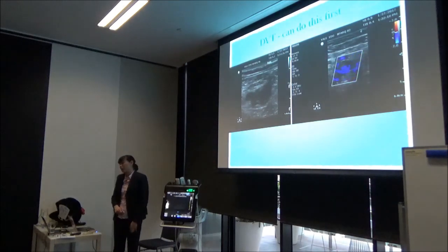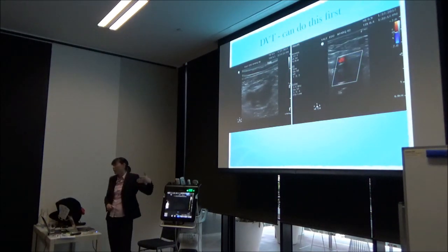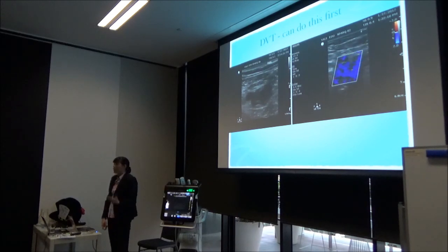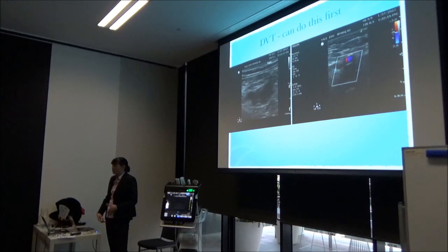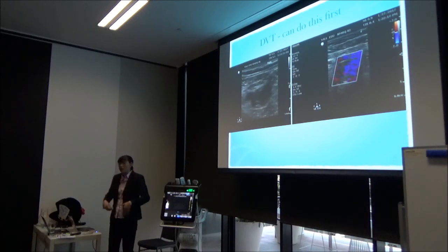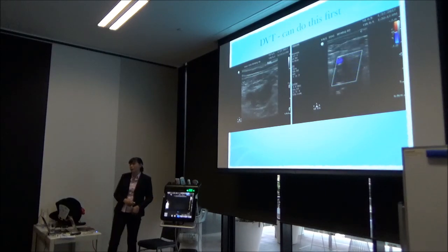And we can't mention the pipes without mentioning DVT. I don't focus on this so much because DVT is not acutely life-threatening. However, if I really suspect it, I might go here first, because the nurses and whoever are doing all of this roll pads and whatever up here, so I might choose to go look at DVT first.